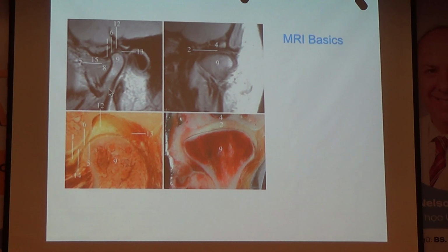I usually request the service to give me a CD-ROM of the patient's images, so you can move through it in the computer yourself to find the best picture that describes the problem.